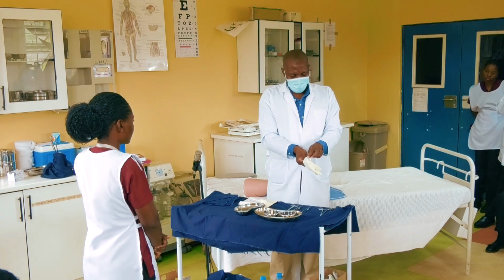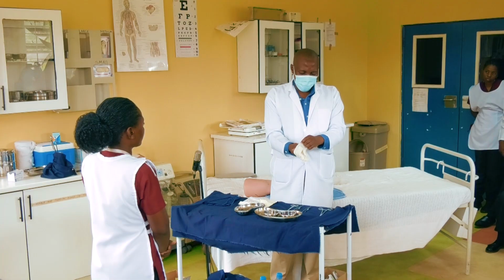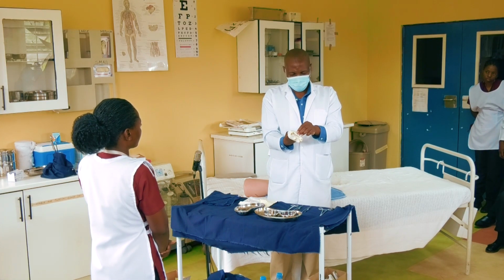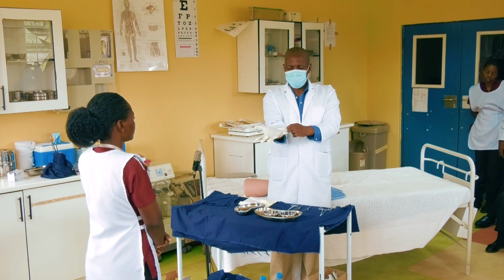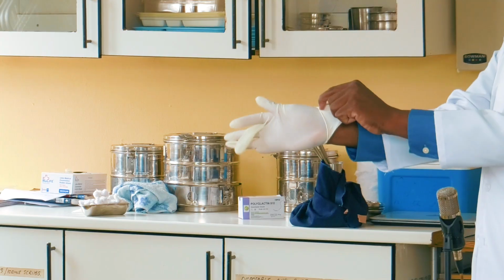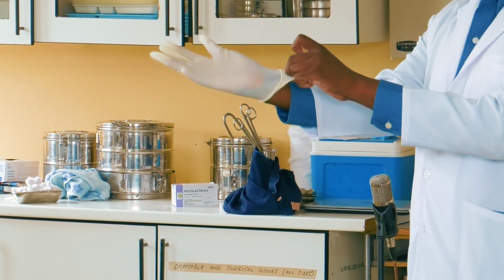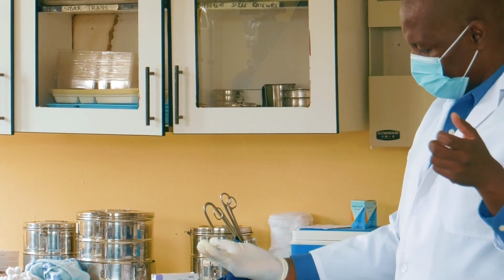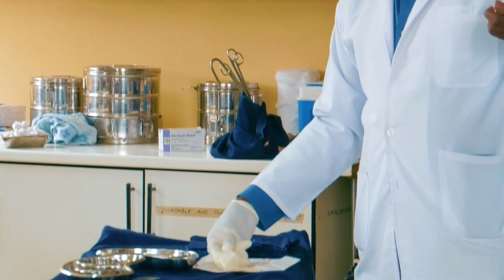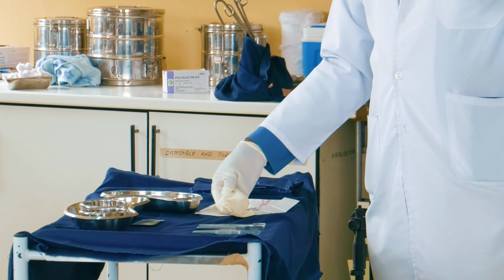So I'm touching the inside of the glove because it's going to be in touch with my skin. Don't worry how the fingers will go in there. Don't touch the outside with the other hand. I don't mind if two fingers are fighting for one hole, I'll sort them out later. I'm still touching just the inside, then I'll let go. Then this outside part is going to be in touch with the patient. This part should go in like that. Then this other finger that remained goes like that. Yes, that's what we do.